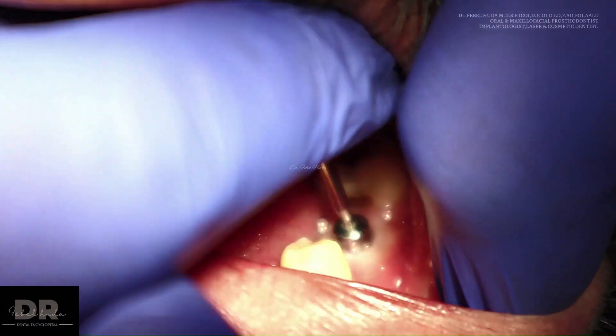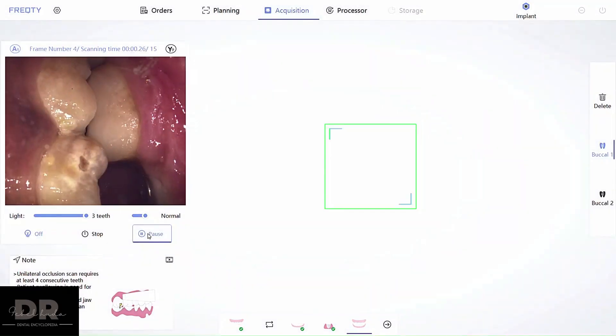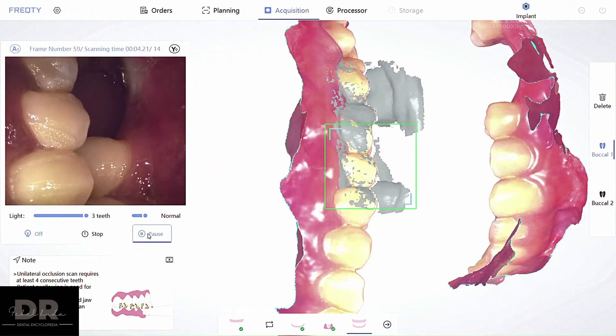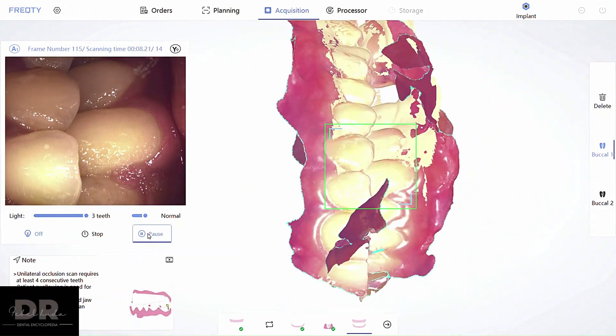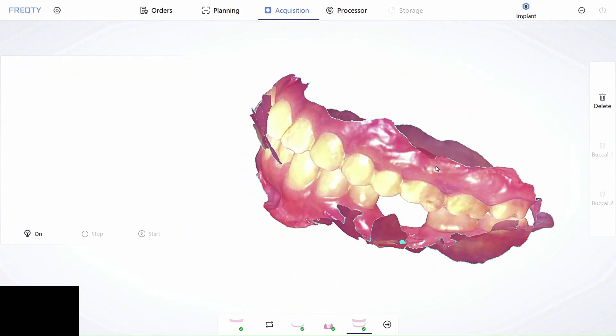Once this is done, replace the healing cap and record the bite. When you ask the patient to bite and start to scan, you can see both images that were previously captured start to lock in. Once this happens, the entire process is complete.